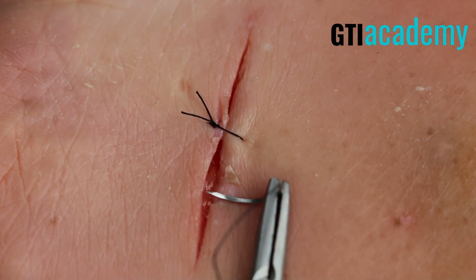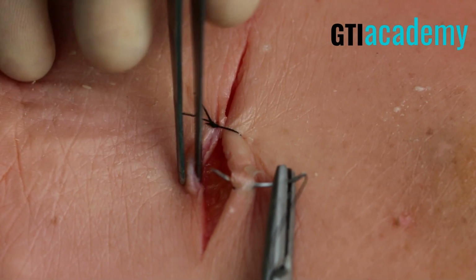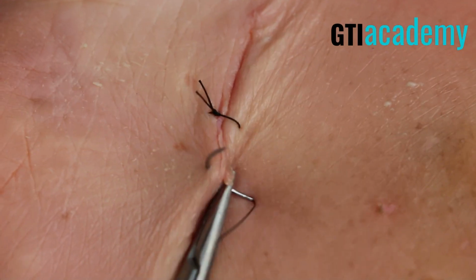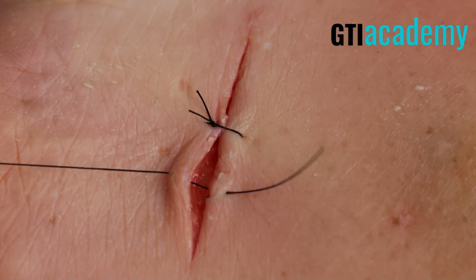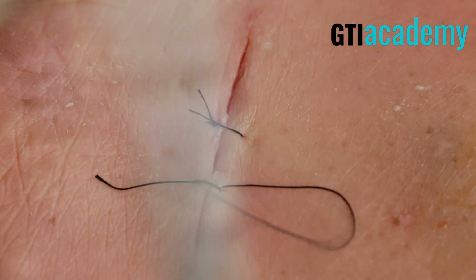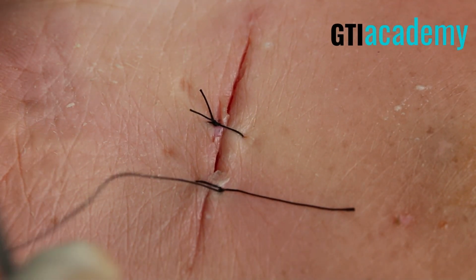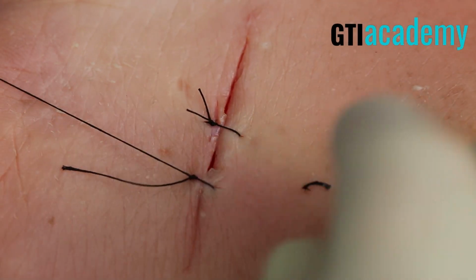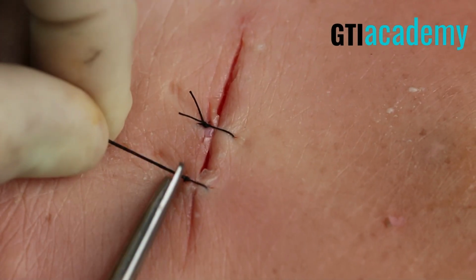So now look at the middle of the wound, measure the distance to the end, and we're going to put one right in the middle. Again, this will allow equal distance in between each suture. Complete the circle. Wrap the suture twice around the needle driver. Notice it's flat, then once, and a third time. We're going to repeat this for each of the wounds. Look how well the wound is approximating.